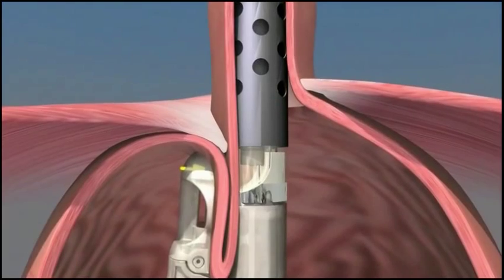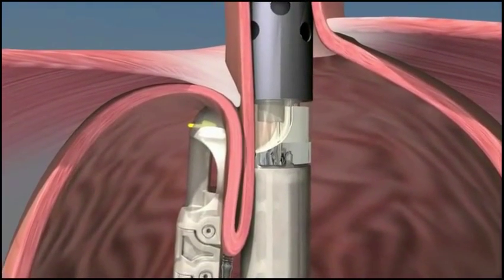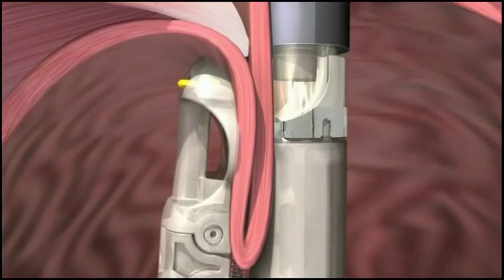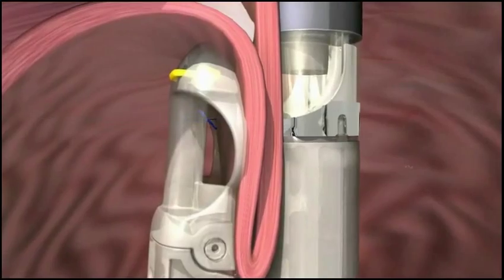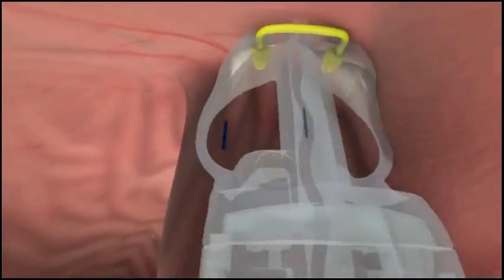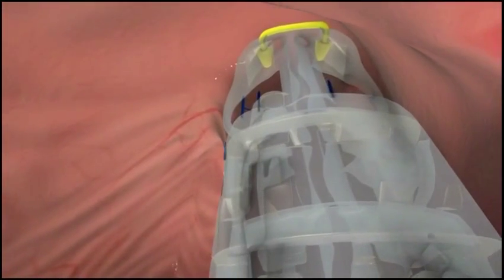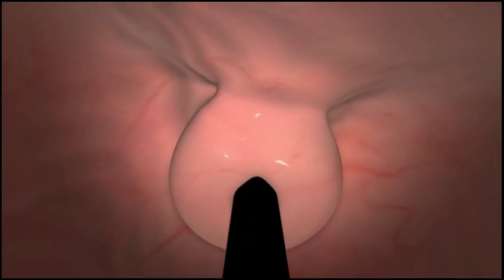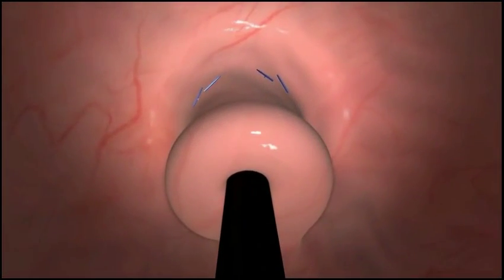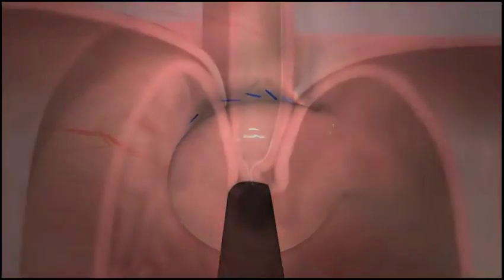The EsophyX device is then rotated, wrapping the fundus toward the lesser curvature of the stomach. Under visual control, the EsophyX device is then used to deploy two H-shaped fasteners to hold the fold of tissue in place and maintain the wrap. The wrap is then tightened further and the next pair of fasteners are placed one centimeter above the Z-line. This procedure is repeated on the opposing side. The valve is extended, creating a long three to five centimeter flap and securing it with H-shaped fasteners.